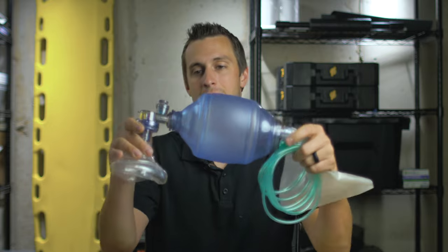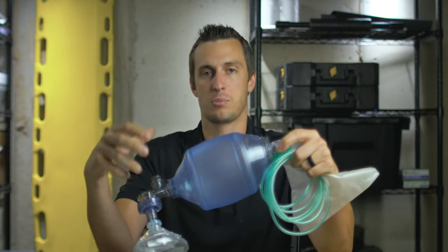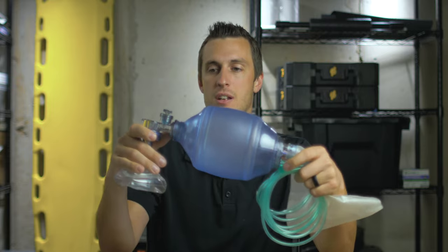We're going to take a quick look at a BVM, or bag valve mask. This is a device that is used for artificial or positive pressure ventilation on a patient that is either not breathing or that is really struggling to breathe. We can use this device to help push air into their lungs.